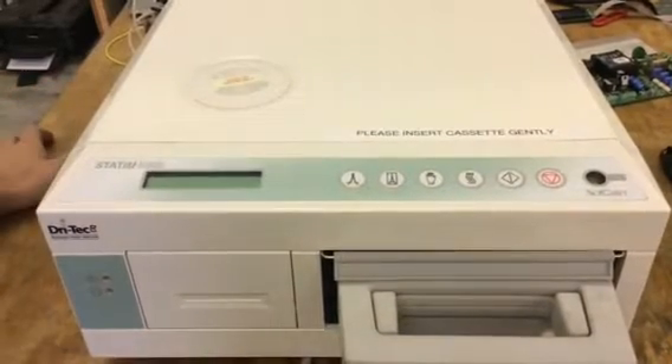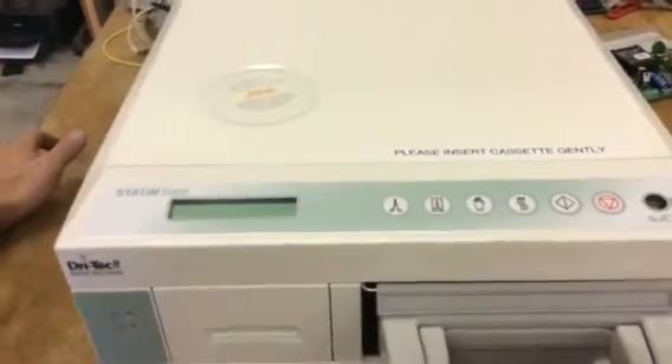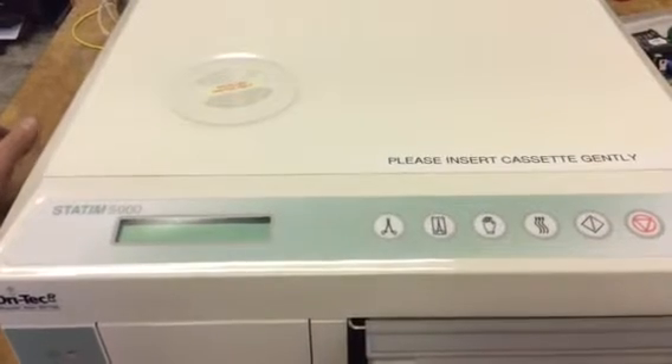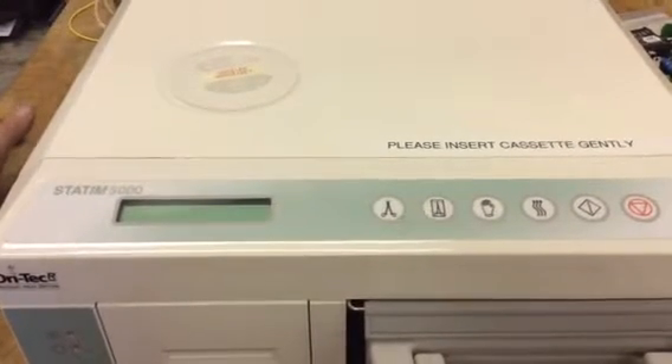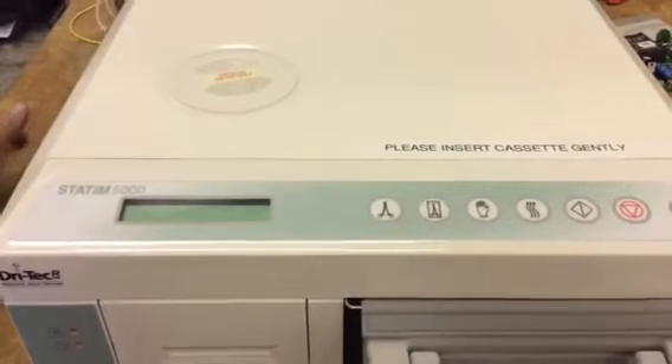Statumusa.com — sterilizer autoclave solutions, 704-966-1650. We're going to show you how to get into service mode on a PCB 6 or 7 for the Statum 2000 or 5000 machine.